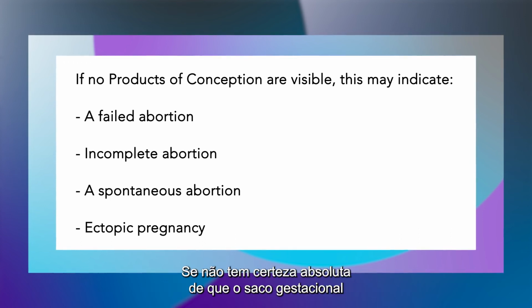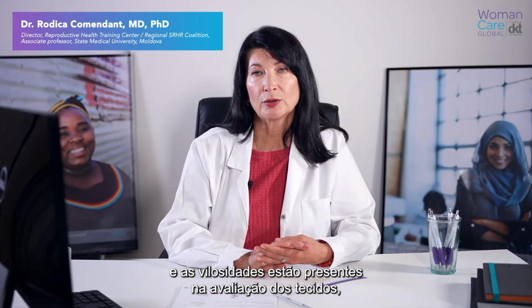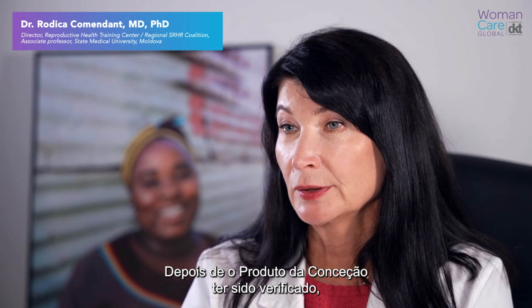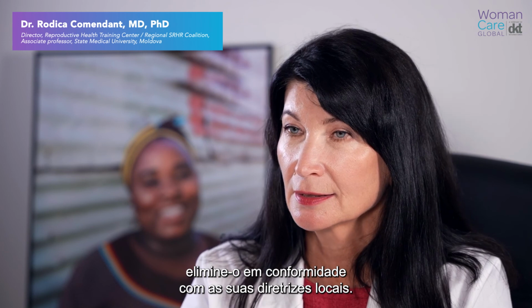If you are not absolutely sure that the sac and villi are present on tissue evaluation, re-aspiration should be done. When the products of conception have been checked, dispose of them as per your local guidelines.